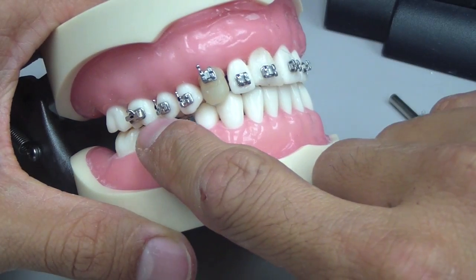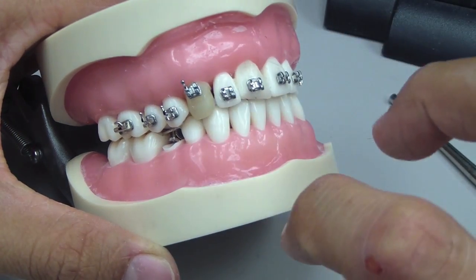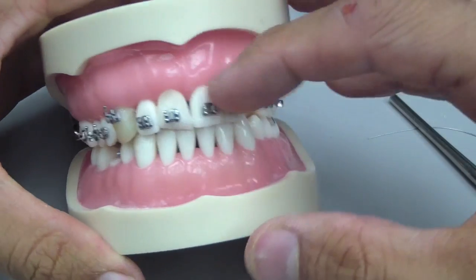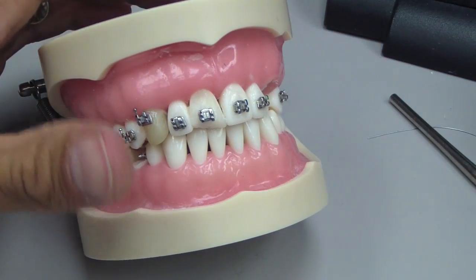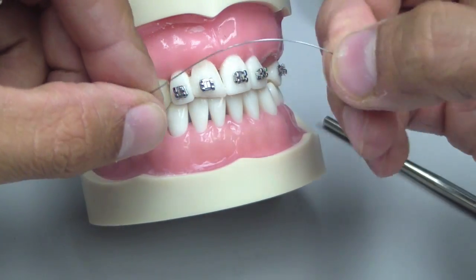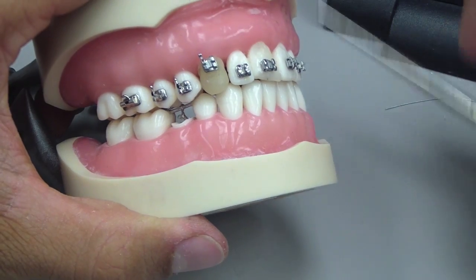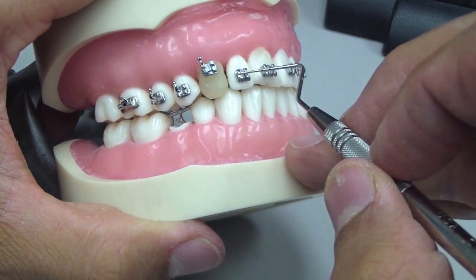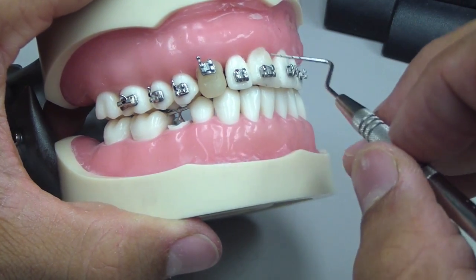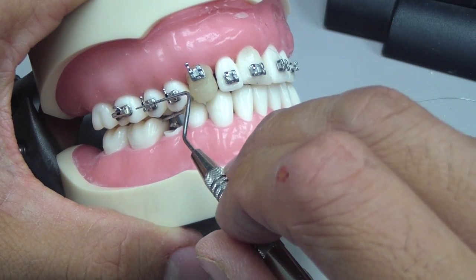In this case what we're going to do is place fixed orthodontic brackets. In the last case I just showed you, as the patient calls it, just the first quadrant — though in retrospect I would have just done the entire arch. We're only going to be using a 0.014 Ni-Ti wire, so it's a fairly flexible wire. We placed orthodontic brackets and appliances, and what we're looking for is to make sure we're preventing unwanted movement of adjacent teeth. So we're going to place these brackets as close in one line as possible.